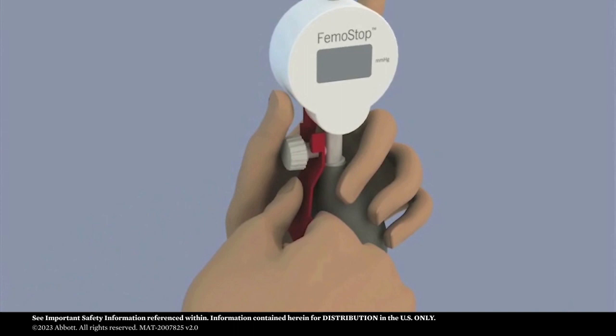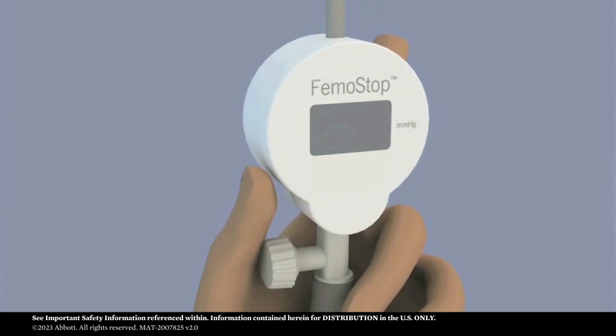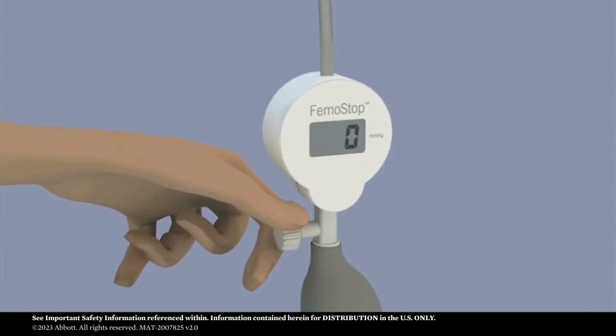Start by activating the pump. Pull the red battery contact tab in the direction of the arrow. When three lines are shown on the display, the pump is activating. When the activation sequence is complete, the pump is ready for use and a zero is shown on the display.